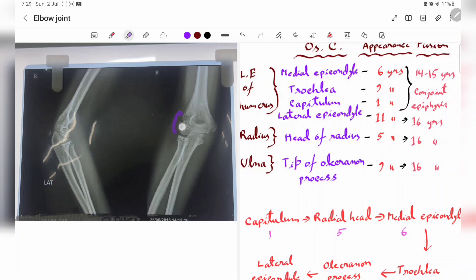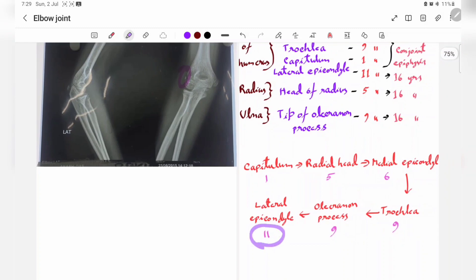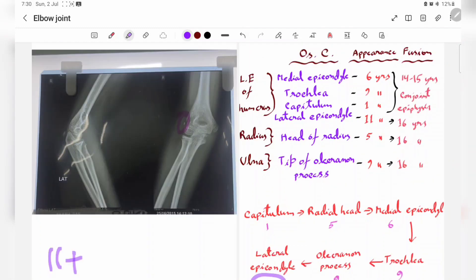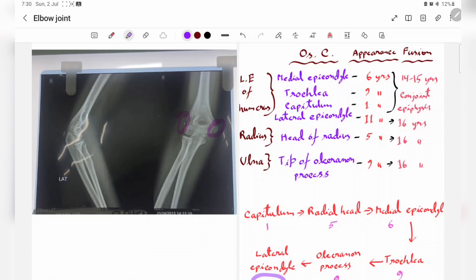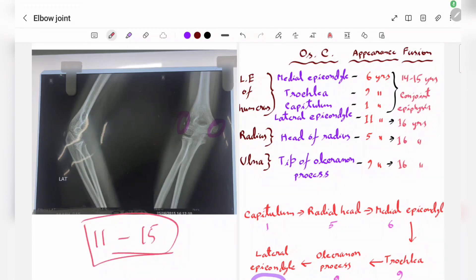In this last X-ray, the lateral epicondyle has already appeared but not fused, so the person is obviously 11 years or older. The medial epicondyle has formed but not fused, placing them below 15 years. Therefore, the age is 11 to 15 years. That's all about age determination from elbow joint X-rays.